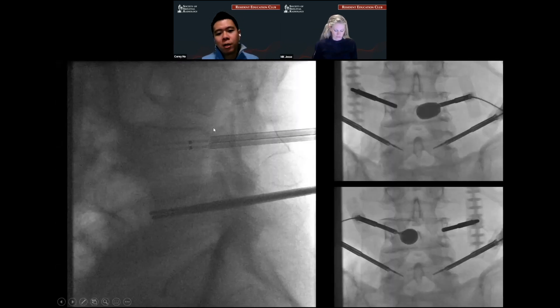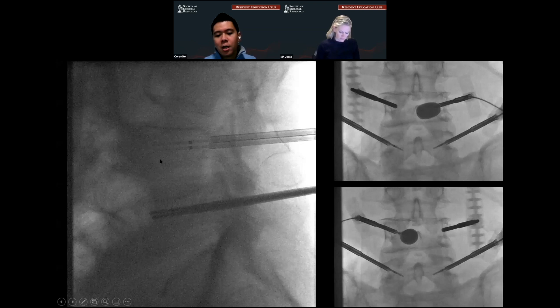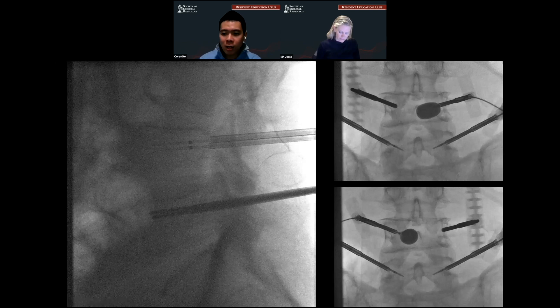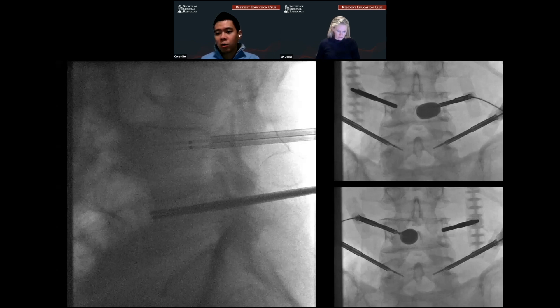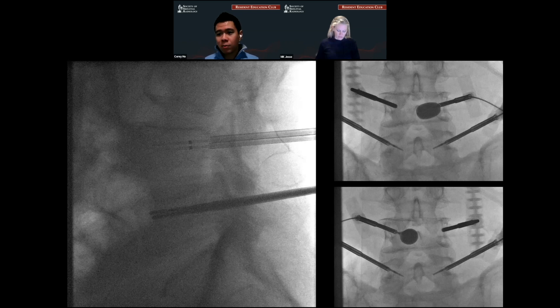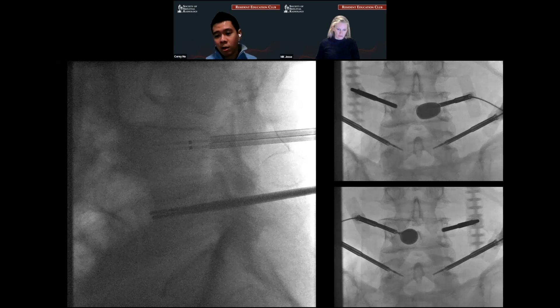We've placed the probes here. The probes are indicated with this radiopaque marker and it goes all the way out to the end. We're drilling for the mapping of the zone below. For this case, because we saw significant tumor infiltration in the L4 vertebral body, I like to create a cavity. Imagine that your normal vertebral body is now no longer bone — there's no osseous matrix inside there, it's just a ball of tumor. That's why I like to create a cavity in order to put some cement in where that balloon blows up, because you really can't predict where the cement is going to go since you don't know what the tumor has done on a microscopic level.